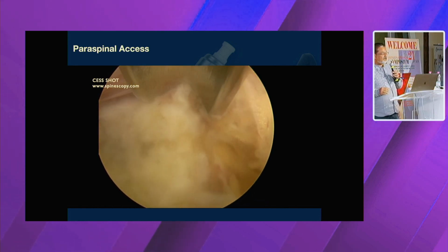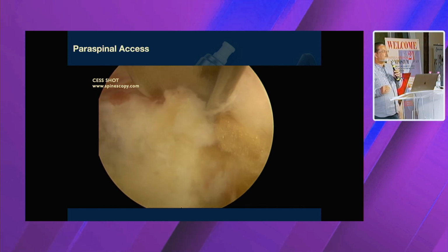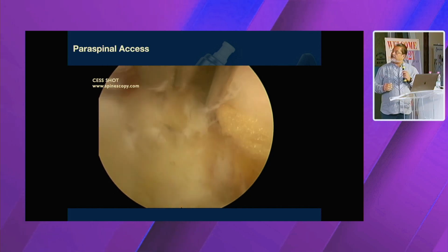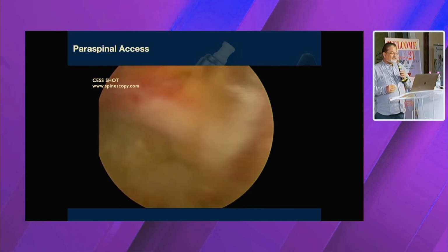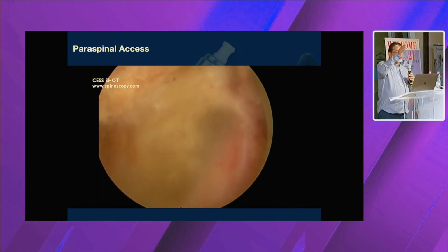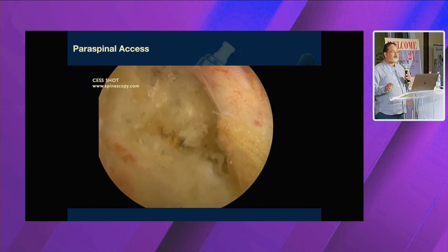Confirm the decompression completely, that there is nothing underneath. You may find some everted margins of the annulus, which is collagenized, which can be taken off in bits and pieces. A final annuloplasty and shrinking of the nearby tissue till you see the entire root coming from the canal to the extraforaminal region can be seen here, and that marks the end of the surgery.